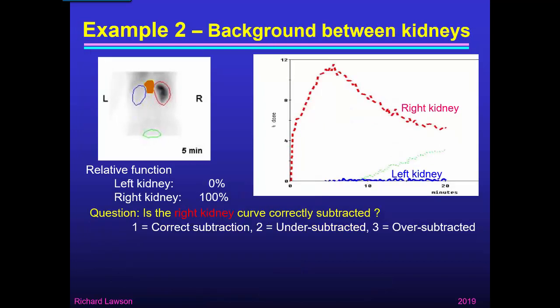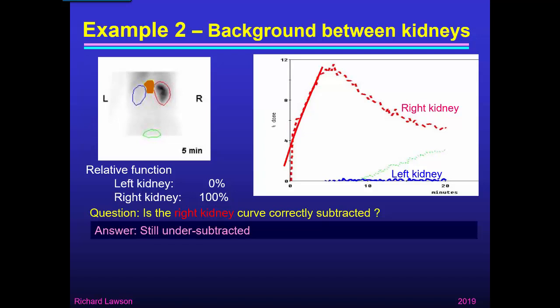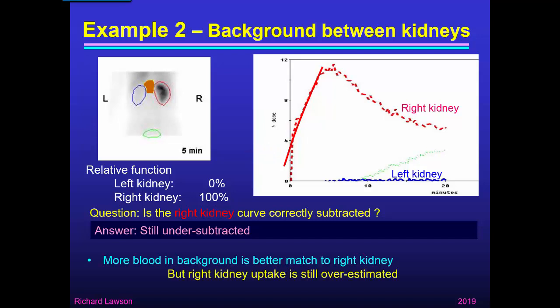Let's try something else. I've taken a brown background region above and between the kidneys, which has some blood and some tissue over the aorta. Looking at the right kidney curve — if we extrapolate it, it still ends up starting above zero, so there is still blood background present. There's more blood in this background region than in the previous one under the kidney, so that's a better match to the right kidney, but the right kidney uptake is still overestimated.